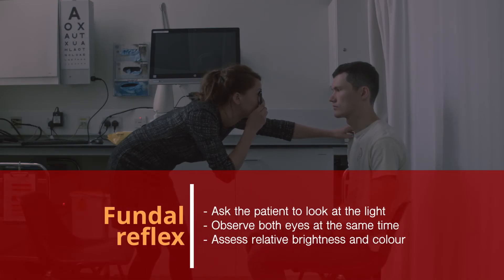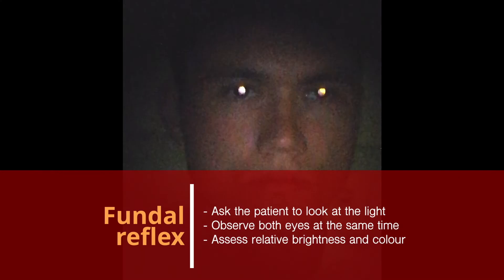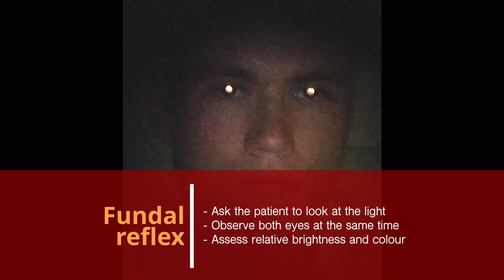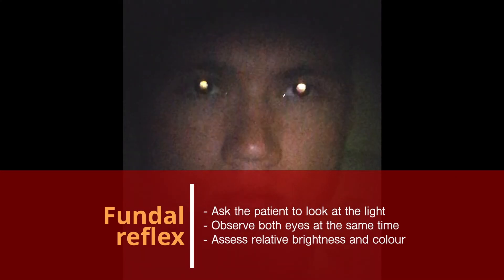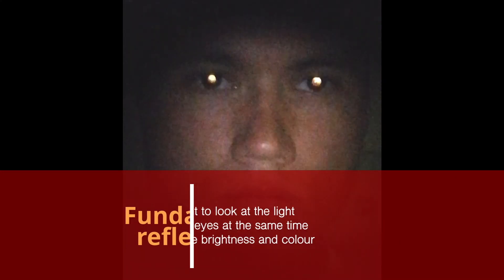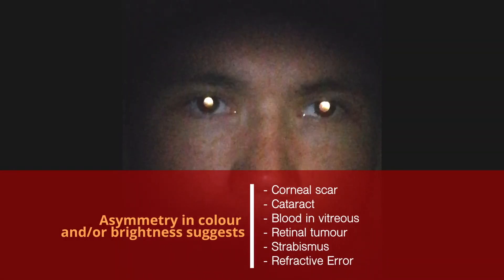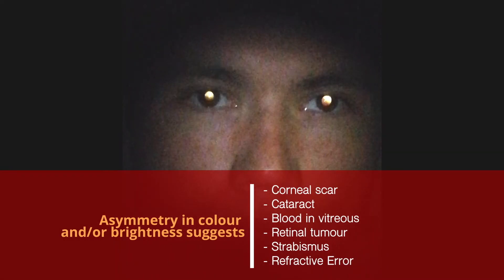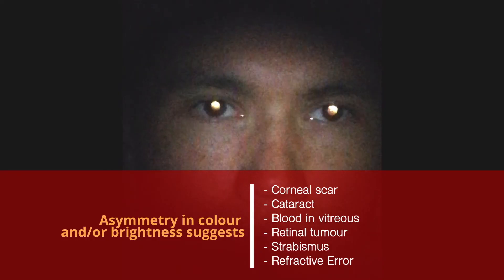Ask the patient to look at the light, observing both eyes at the same time. The light should reflect from the fundus back through the pupils, looking symmetrically bright with similar colour. Any asymmetry suggests an abnormality such as corneal scar, cataract, blood in the vitreous or a retinal tumour.